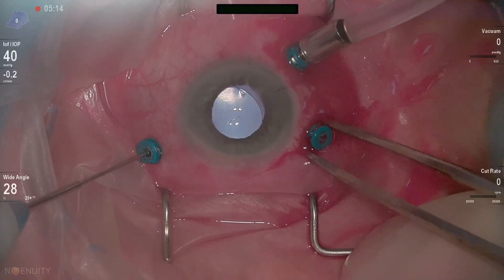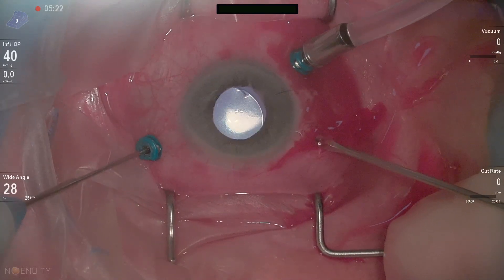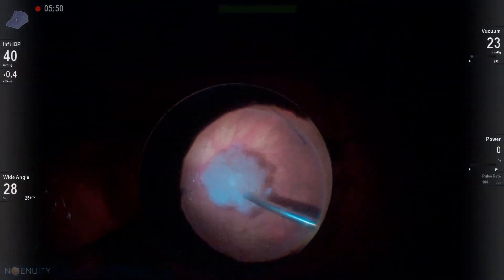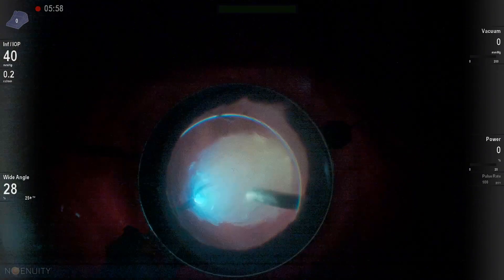You can see we've got a lot of cortex out. But at this point, there's a big piece of nucleus back there — almost the entire lens. So we'll remove our 25-gauge cannula and open this sclerotomy up to incorporate a 20-gauge fragmentome.